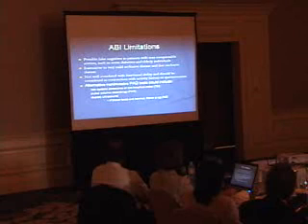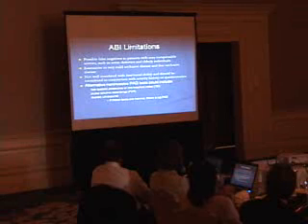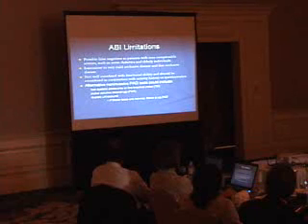With any test, the ABI does have its limitations. You can get inaccurate results with diabetics and patients who have renal failure as well, as their vessels are non-compressible distally, and it can be very insensitive to mild occlusive disease. Kirk is going to talk about some other alternative non-invasive tests, and I'll leave that piece for you.